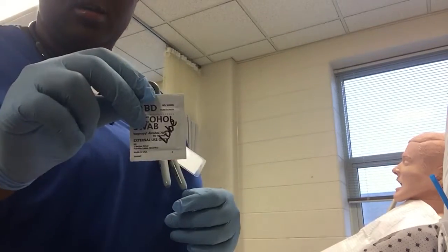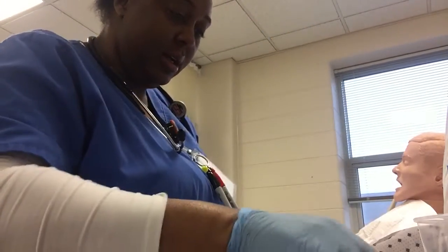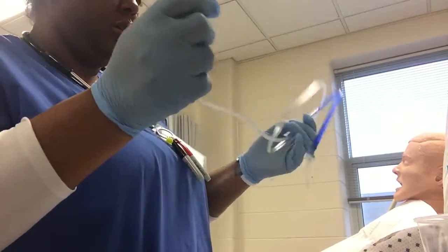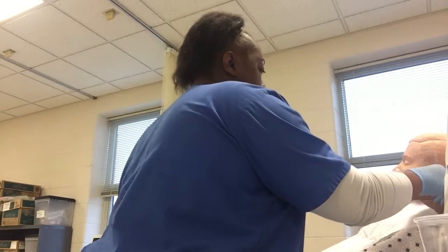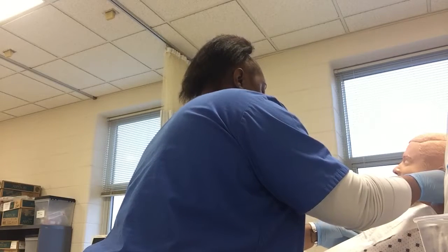And then now I'll get my lubricant. Oh, and I make sure I have my cup of water that's already there. I'm sorry, I will not get the lubricant now. I'll measure first, starting from the nares to the earlobe, and then from the earlobe down to the xiphoid process.